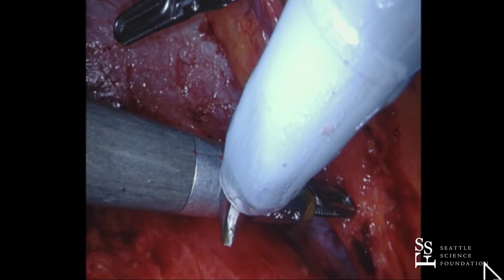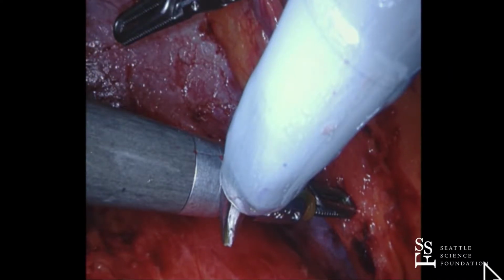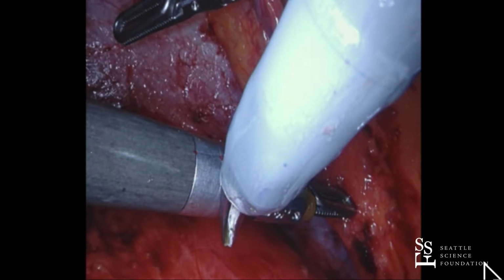I just make a giant hole. And then instead of putting my fourth arm, that most anterior port, if you will, right at the edge, I just put it kind of in the transperitoneal space. I do that so that when I bring my prograsp in, I'm actually holding back the peritoneum and the kidney both. So it works well that way.